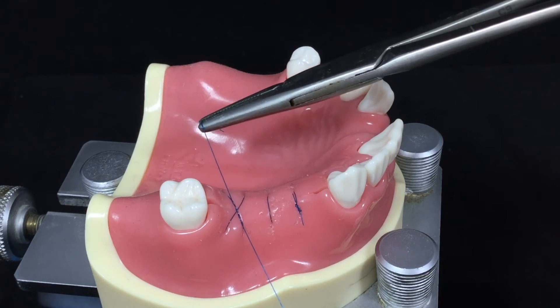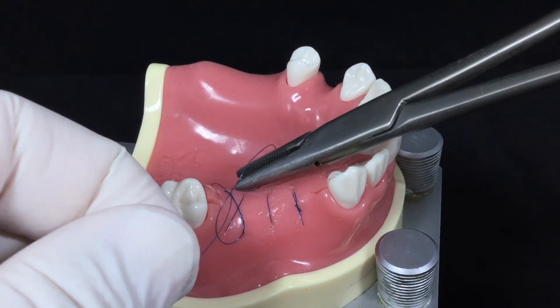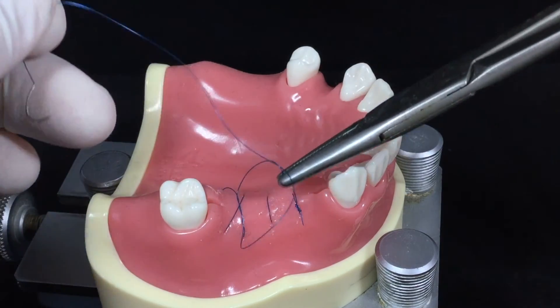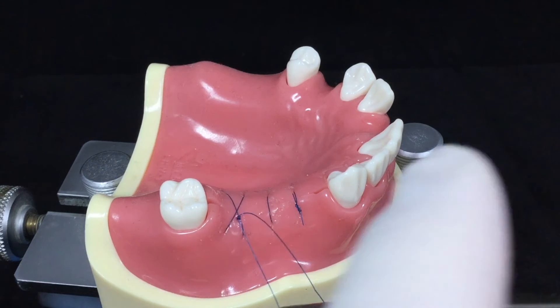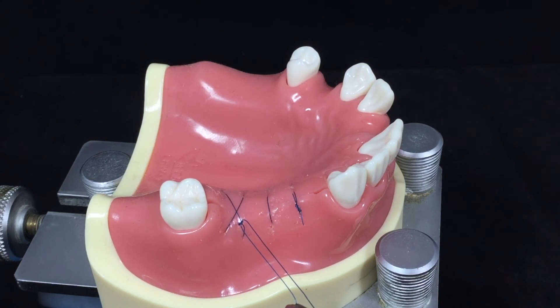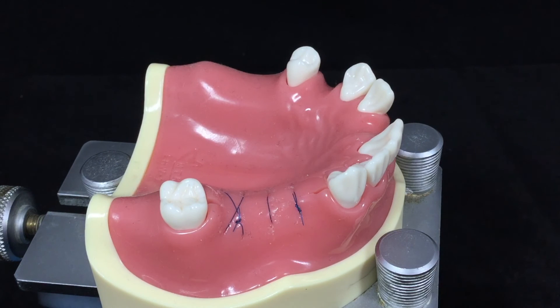You will notice the same downward inverting pressing vector is created by these two suture lines. The only difference is the pressure is more focused in the center of the X mark. This is the criss-cross suture.